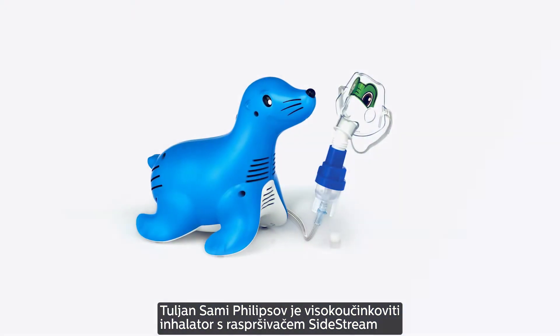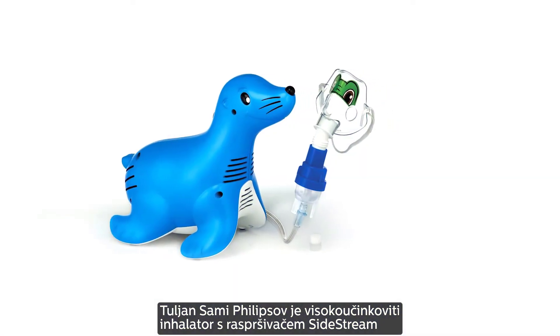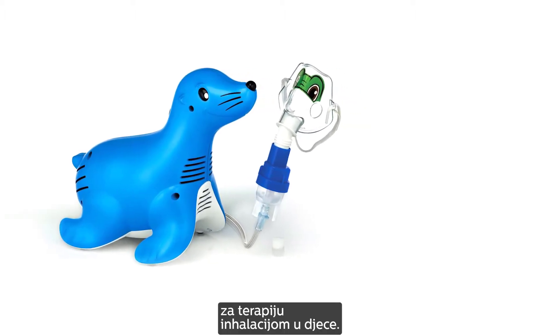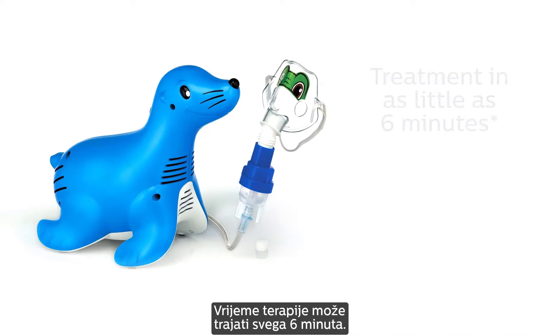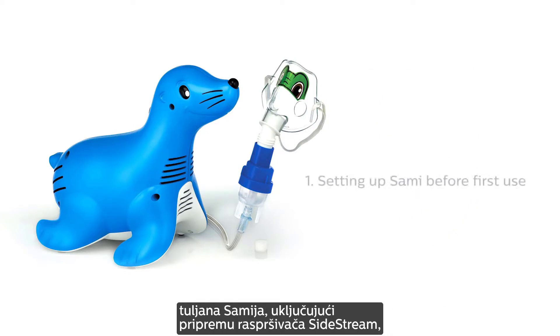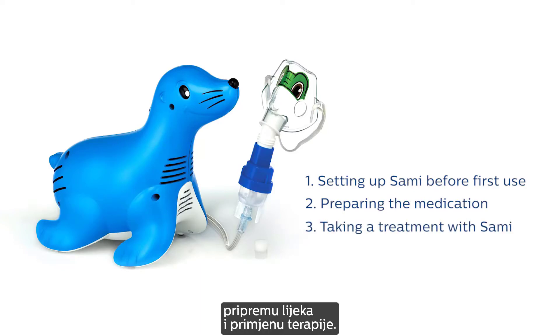Sammy the Seal uses Philips highly efficient Sidestream nebulizer and Tucker the Turtle character face mask to provide a fast nebulizer treatment for children. Treatment times can be as short as 6 minutes. This video shows the different steps of using the Sammy the Seal nebulizer compressor, including setting up the Sidestream nebulizer, preparing the medication, and taking a treatment.